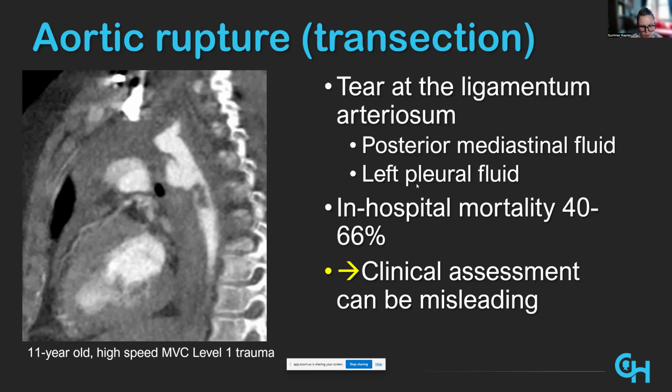So we have a rule of thumb in radiology that you treat the patient, not the imaging. But this is one case where you want to actually treat the imaging and not the patient, because this is a severe injury and there's a small window of time to intervene.